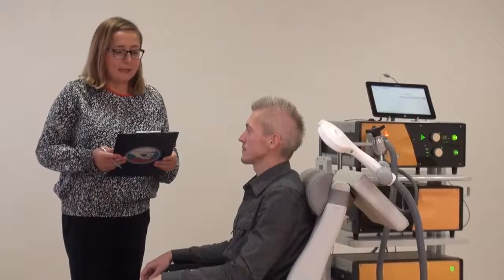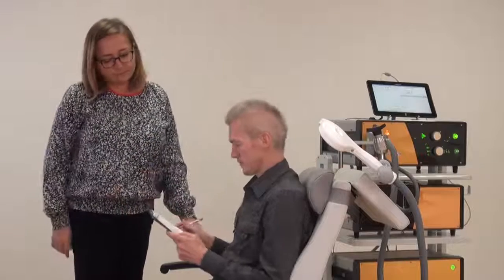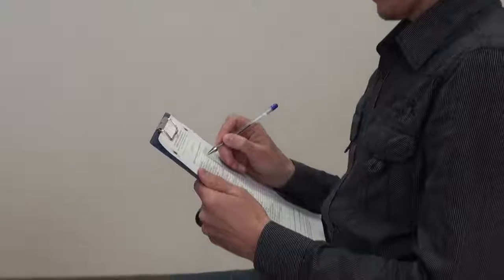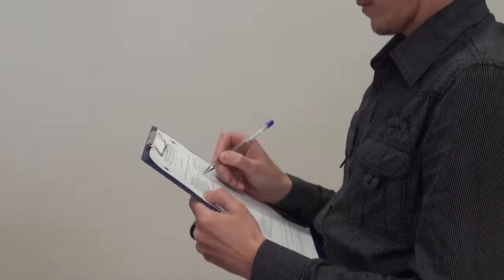Ask the patient to fill in the safety checklist. Make sure that the patient has no contraindication. Don't forget to use earplugs for the patient and for yourself.